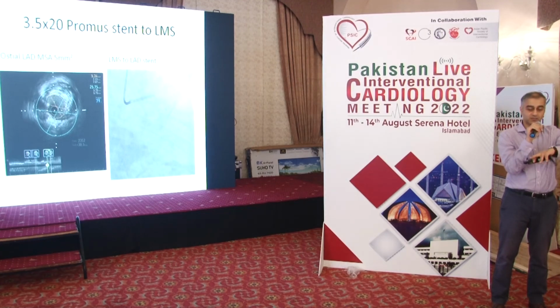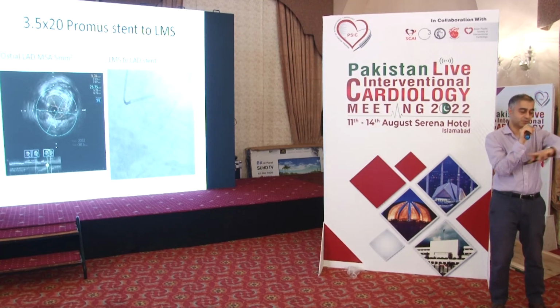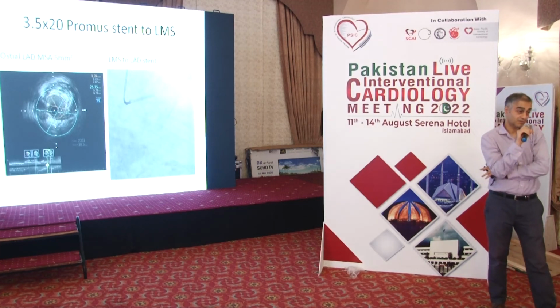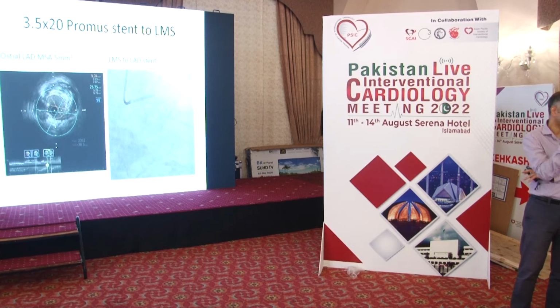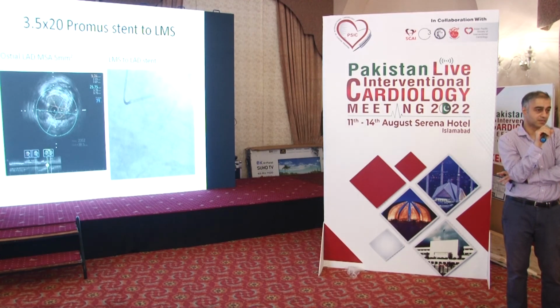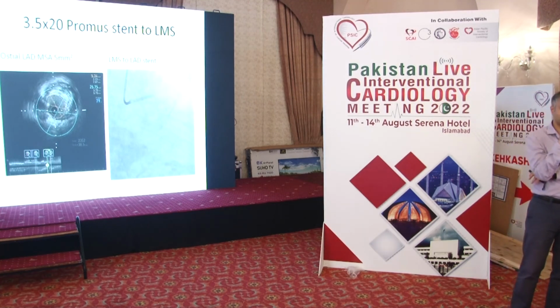So what was interesting, I don't have the IVUS images of this, but when we did the pullback from the circ, there wasn't actually very much disease. There was mild atheroma in the ostium of that circ. So I felt that we could just do a crossover stent here. And this is where stent sizing becomes important, as we were discussing earlier. So I chose a stent that I know is going to be able to grow in that left main stem, because you want to do a proximal optimization, or POT. Next slide.